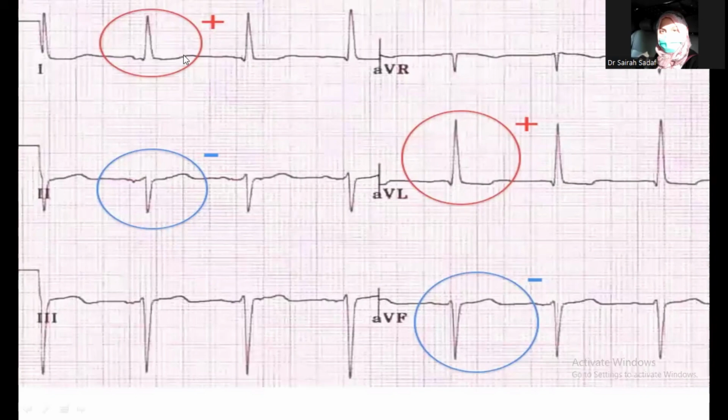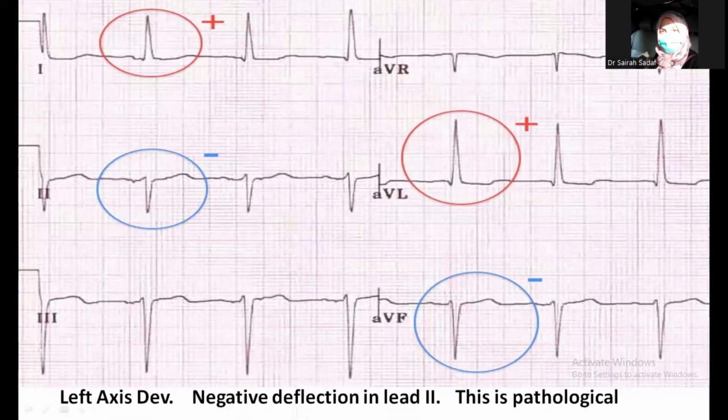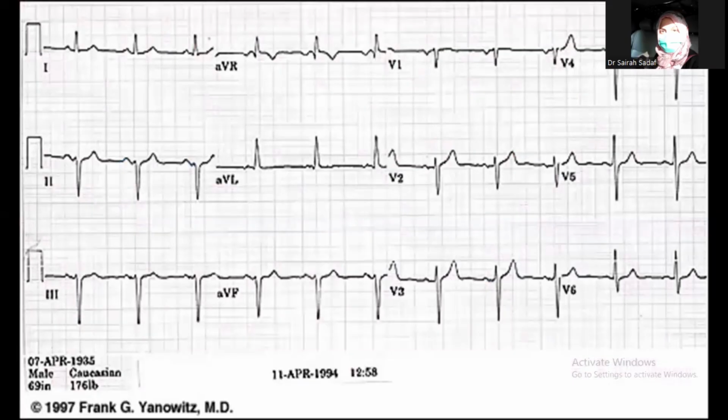This one is pathological left axis deviation. So my online audience, you guys are with me, right? Pathological left. Yes. Good. Very good. Challenging. All right. Thank you for your feedback. Again, this is the same pathological left axis deviation.